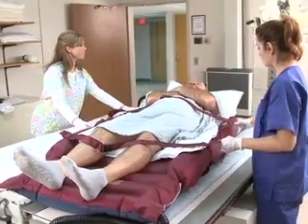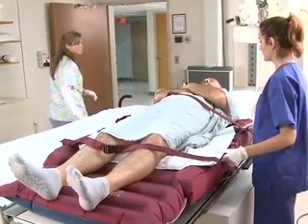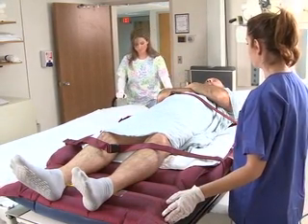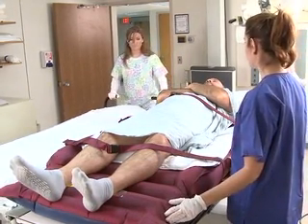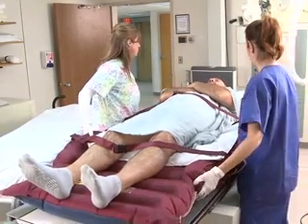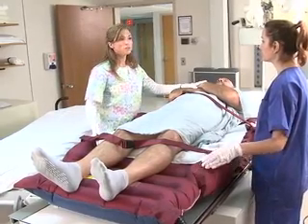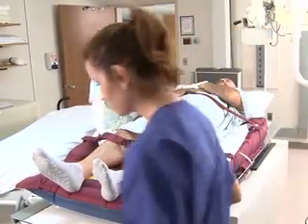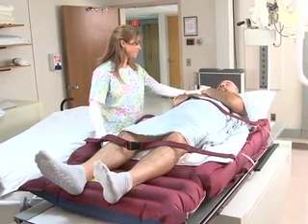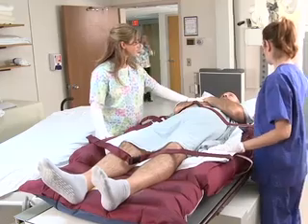Be careful not to over-transfer, as the imaging table is a very smooth surface and the HoverMatt will easily glide onto it. With a caregiver on either side of the patient, reposition the patient on the inflated HoverMatt to ensure that his or her body is centered on the imaging table. Once the patient is in the desired position, one caregiver should assume the position of safety, explain the task to the patient, and instruct the other caregiver to turn off the air supply.